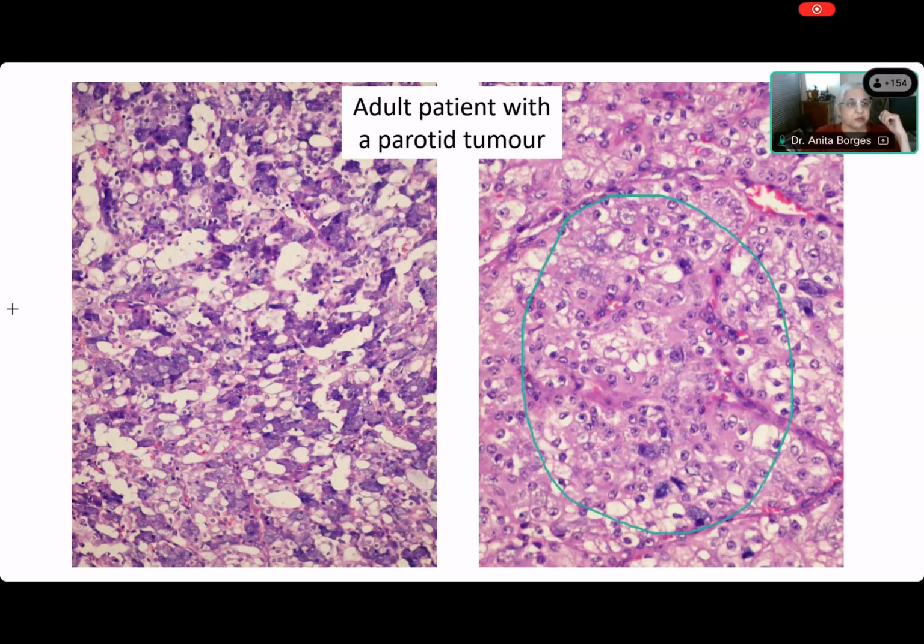All right. But what is happening over here? What are you seeing here? Eosinophilic cytoplasm? No, ma'am. What are you seeing here? There are some clear spaces. Okay. Anybody want to help her, Madhu? What is the cytoplasm like on the left-hand side and in some smaller areas over here? Basophilic. It is not just basophilic, it is basophilic and granular.